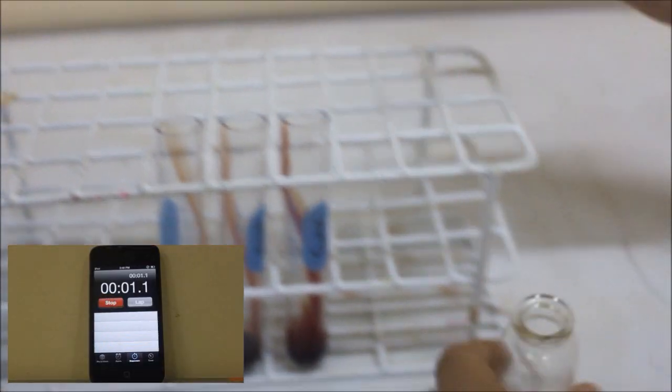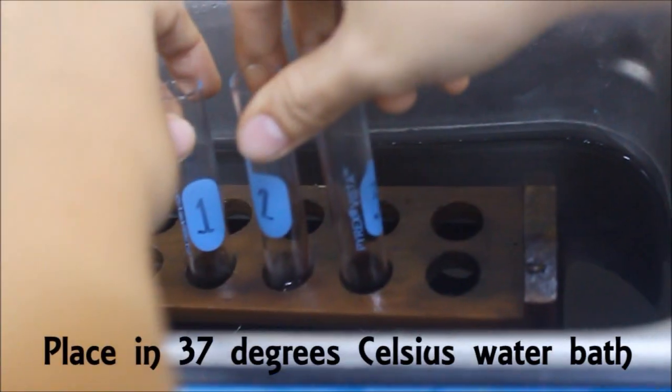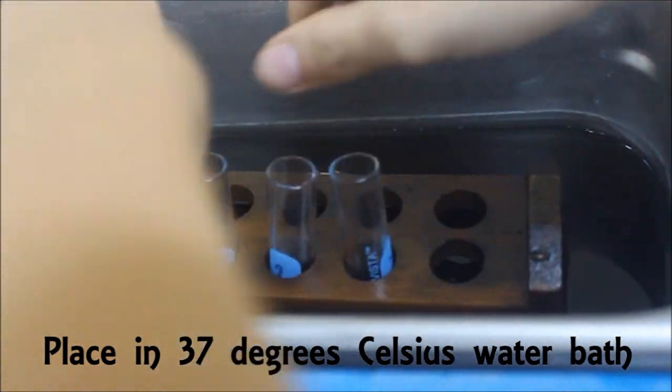Start the timer as soon as the blood is placed in test tube number 3. Discard the last 1 mL of blood. Place the test tubes in a 37-degree Celsius water bath.